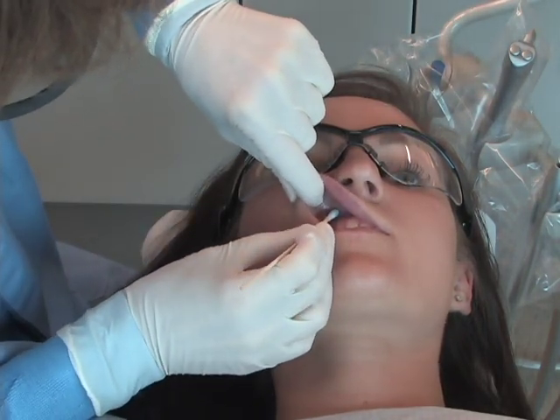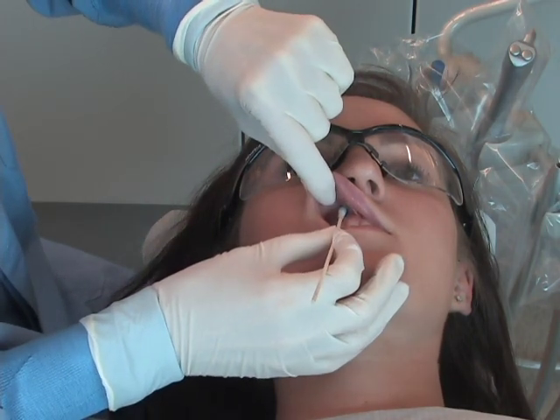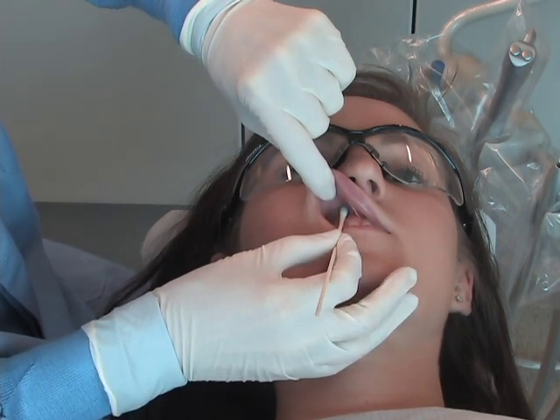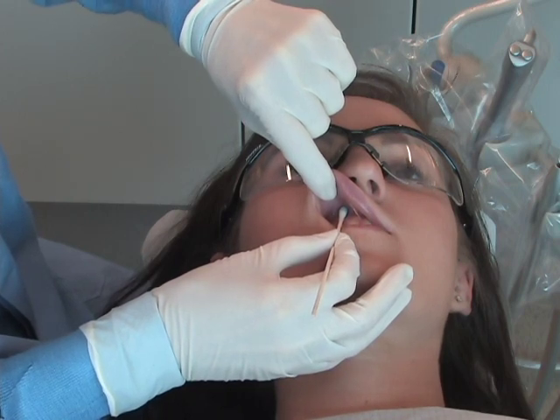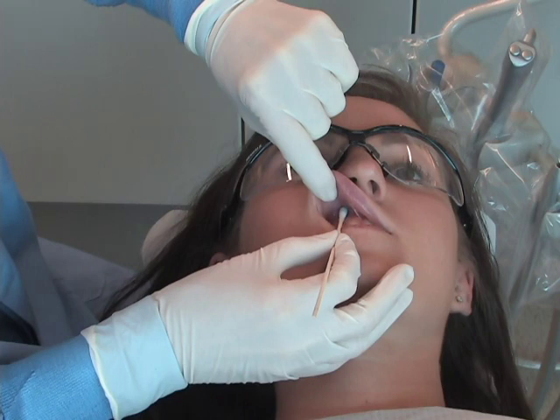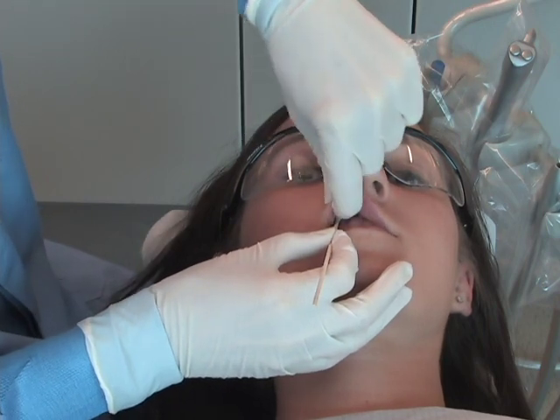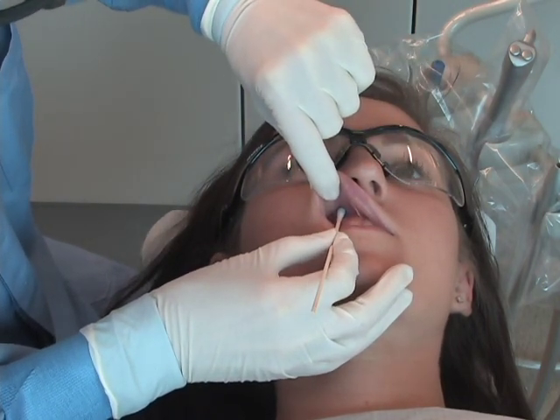Remember that topical anesthetics also have maximum safe dosages. Therefore, apply only a small amount for the appropriate length of time. Do not rub the tissues with the applicator, but rather place the applicator on the insertion site and keep the area dry. This preparation time can also be used to rehearse the injection by mentally reviewing the particular injection technique for the area being anesthetized.